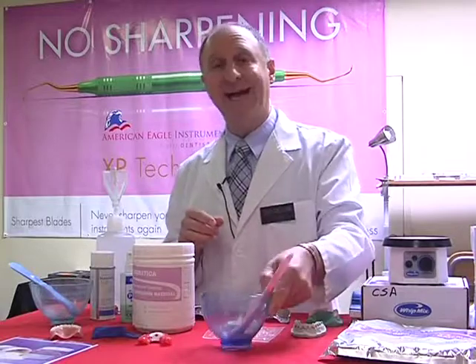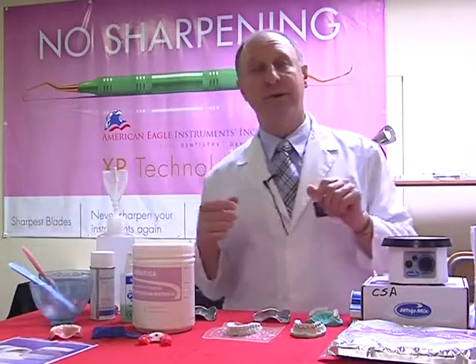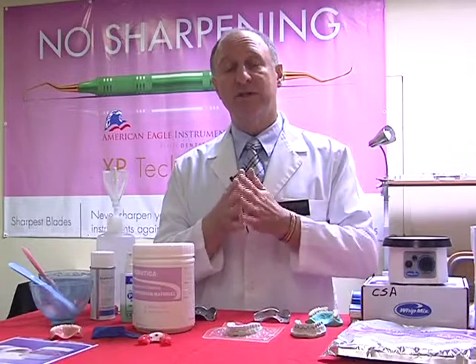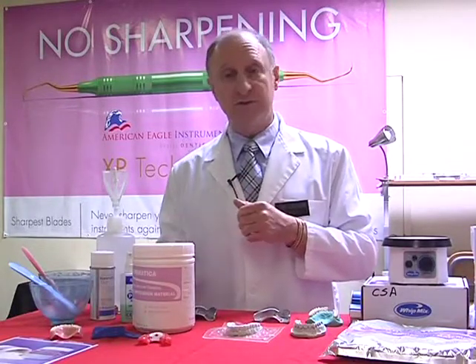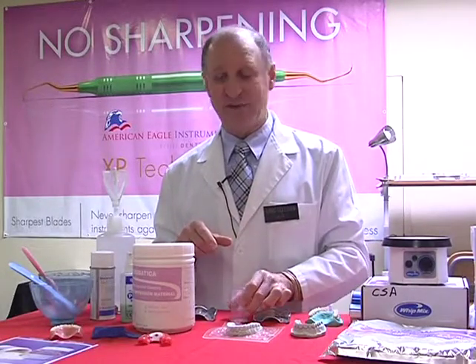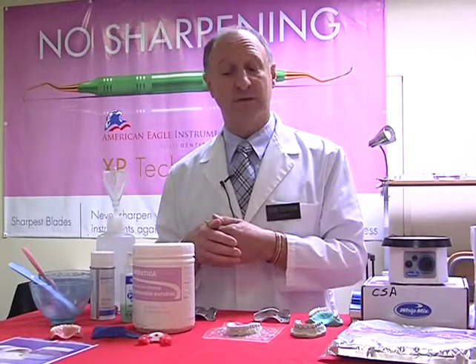So let's have a look at how to mix the alginate. Before I normally handle any type of impression materials, the thing I'm going to be doing is washing my hands under the sink, and I normally use warm or hot water. So what will that do to the water that we're going to be measuring off for our alginate afterwards? It means that normally that's going to be warm or hot. And how's that going to affect the alginate? It's going to accelerate the set, which is no good.